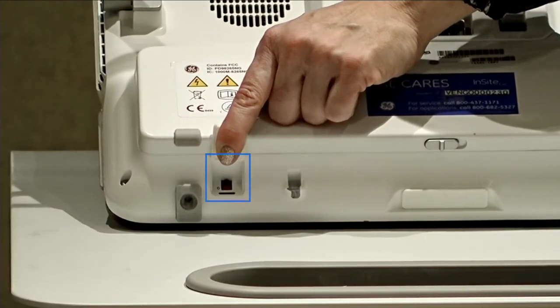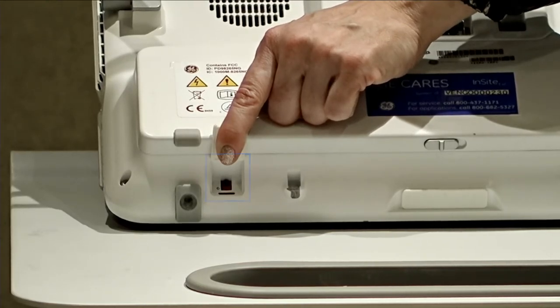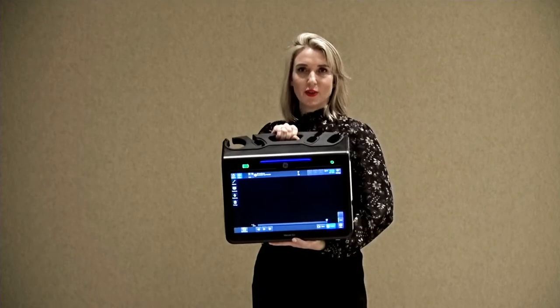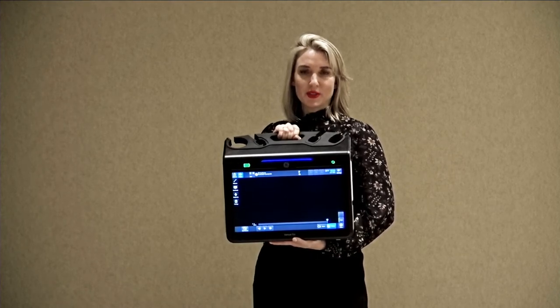When transporting your system, always turn off the circuit breaker to save the life of the battery. The Venue Go can also be placed in a cradle on a boom in the trauma bay or in a procedure room.